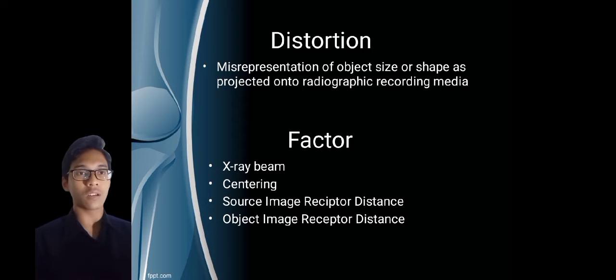Although 100 cm is the universally accepted SID, studies have shown that apart from improving distortion issues, increasing the SID from 100 cm to 122 cm decreases the skin dose despite any need for increase in mAs.